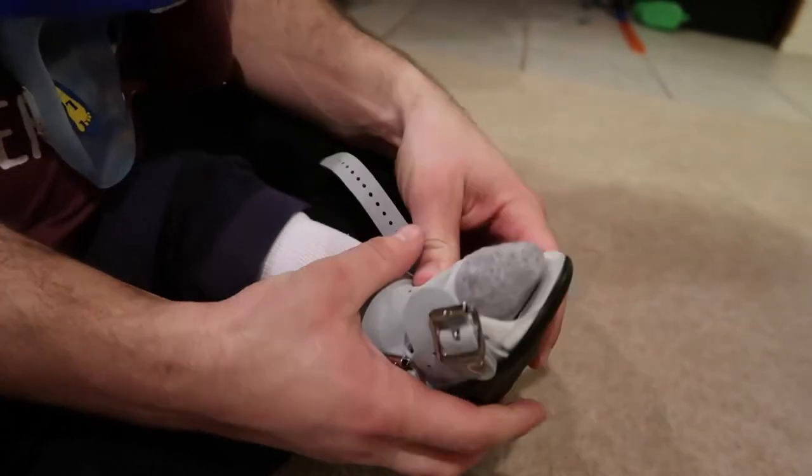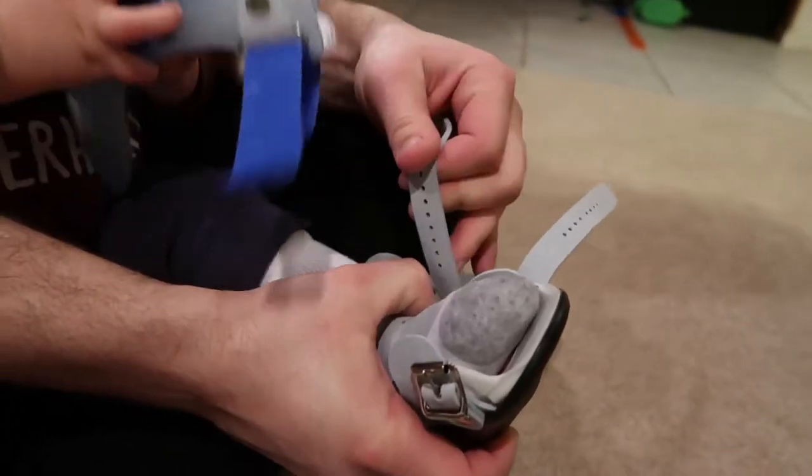Then you always start with the middle buckle.